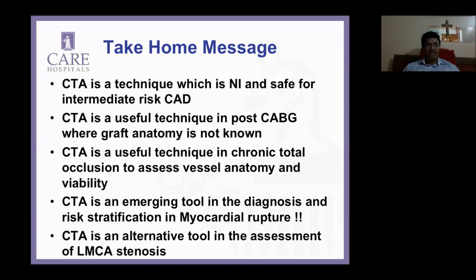So I think we need to refine our own techniques very well. Make sure we are really quantitative before we say which is accurate and which is not. I just put this over the forum. I also do angios, and I'm not very particular about QCA. But in CT, we're pretty quantitative. We actually give some real numbers. In fact, I do cross-section analysis whenever it's required in intermediate lesions. So I give the pre, the lesion, and the post, and the length of the lesion to the interventionist. That's what I do in intermediate or severe lesions. So I think we need to be more quantitative ourselves before we arrive at this interpretation.